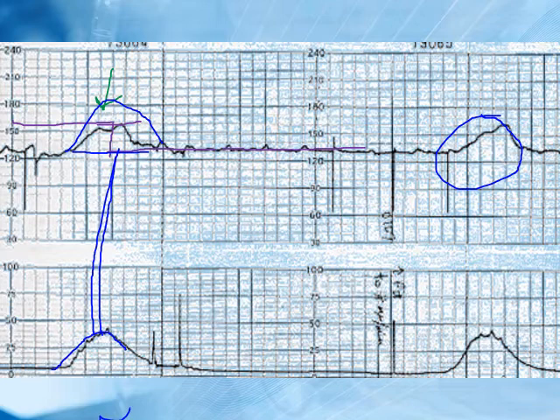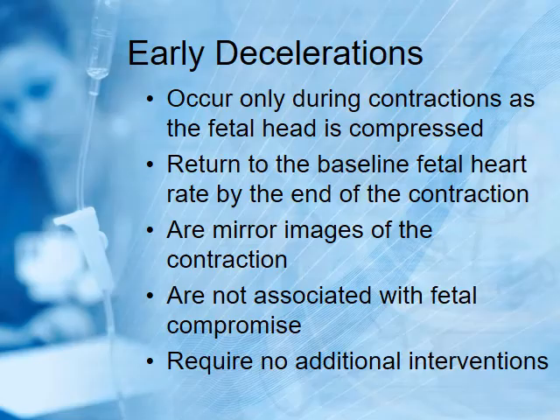I'd say it's kind of minimal, but with this acceleration, that makes it more moderate, because this is actually moderate here. So it looks really good. Early decelerations. We're going to talk about decels now. We've talked about the accelerations, the 15 by 15 rule, remember.